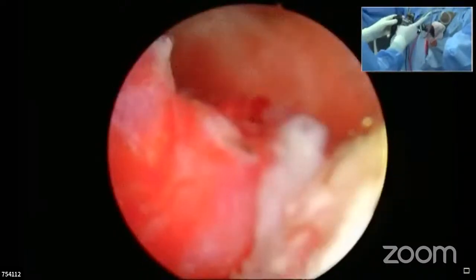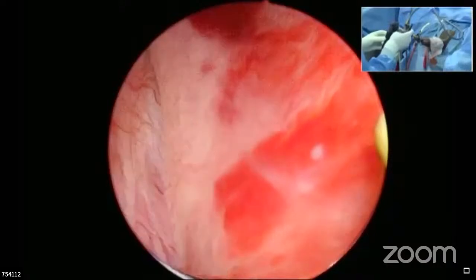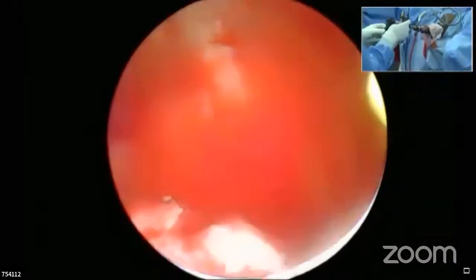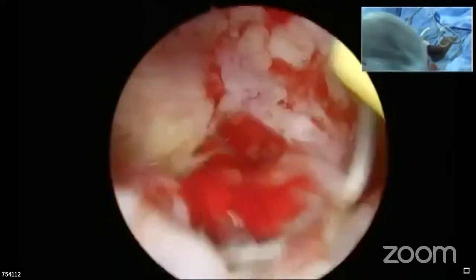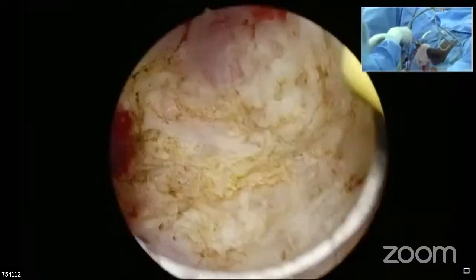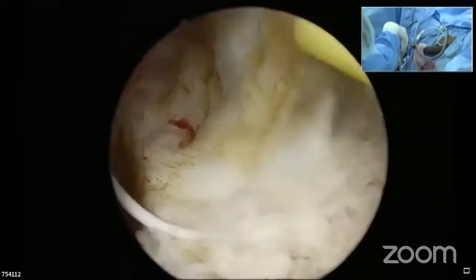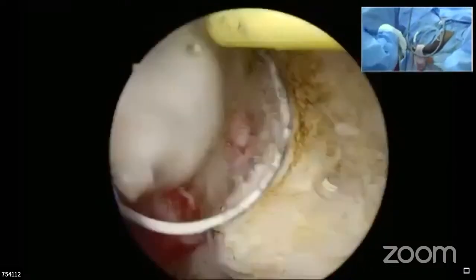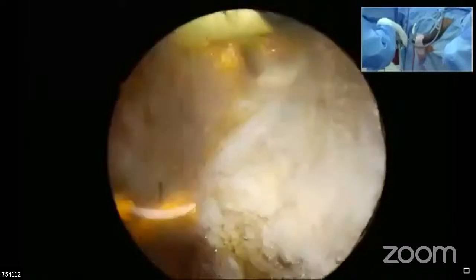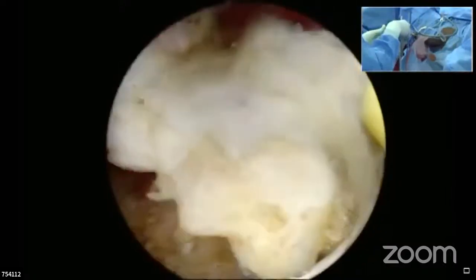Sir, initially the first landmark that I showed was the junction of the adenoma and the mucosa. That is a landmark that has to be resected and enucleated out. So rather than shaving, as we have been discussing, you need to scoop it out, preserving the mucosa. There is always compromised long-term result if the apical tissue is left behind. So you have to scoop out the adenoma instead of shaving it. But yes, the overlying mucosa and the sphincter have to be preserved. So it has to be a scooping movement, but nevertheless a complete one.